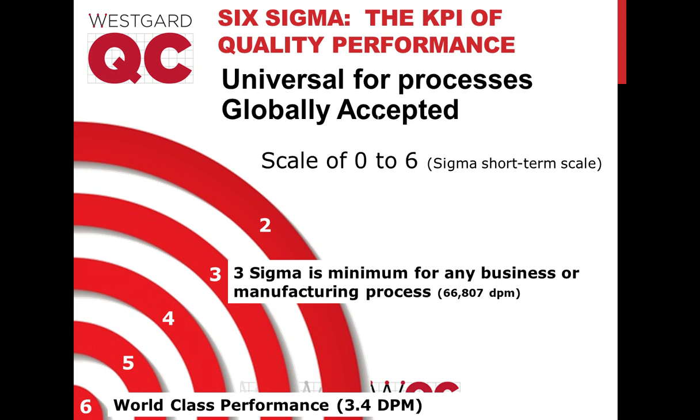Thank you, Sten. Now let's come over to a question from Tyler. Can the lab use a different Westgard multi-rule definition? For example, 3-1S as a warn rule instead of a systematic error run reject rule?